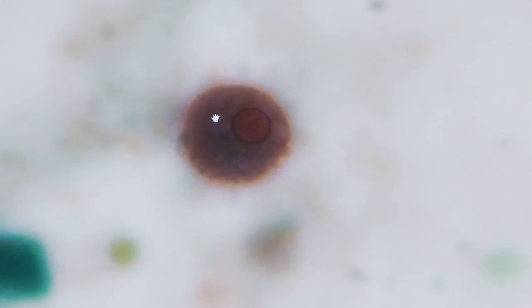Cytoplasm. Here we have probably a vacuole here. There's a funny round body seen in Entamoeba polecki trophs and cysts on occasion. We don't know what it is, but these are mainly vacuoles. I'm not sure if that's actually what that is. This looks to me to be a trophozoite. Once again, very, very big nucleus, evenly distributed peripheral chromatin, slightly eccentric but quite large karyosome. But that size of that nucleus is very helpful.